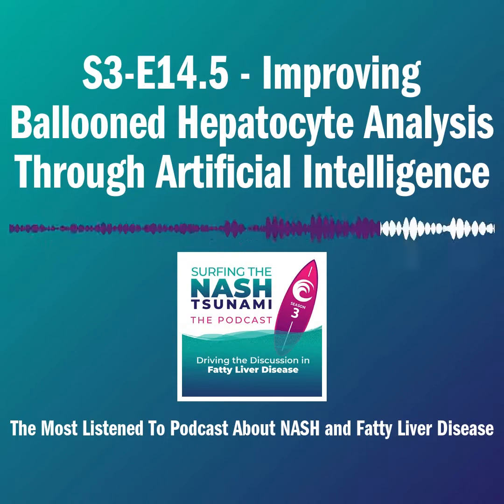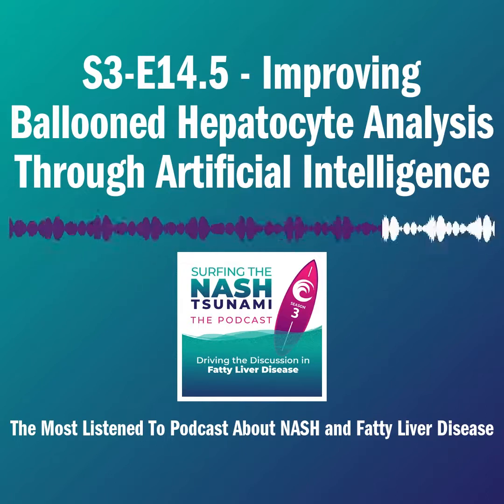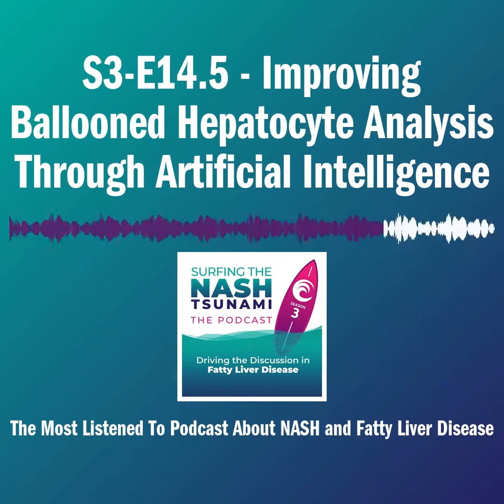So I'm a total believer in cirrhotic trials. Whatever you're looking for, you really need machine learning and artificial intelligence, because this conventional thinking that we need one-stage fibrosis improvement is great if we can get it, but it can be very difficult, and we could be missing a lot of fibrosis changes in cirrhotics just by looking at this conventional one-stage fibrosis improvement.